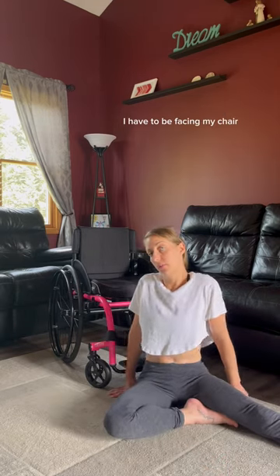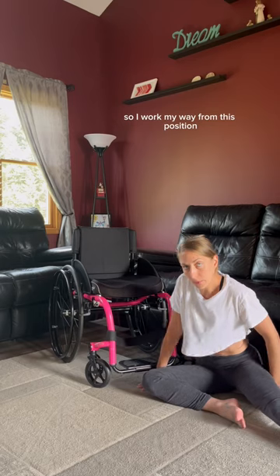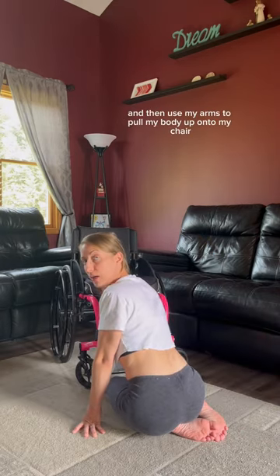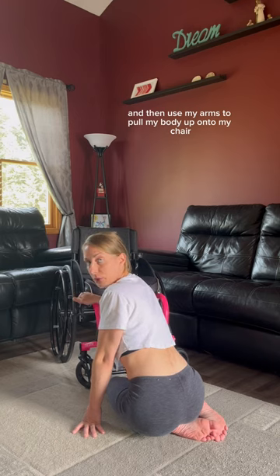To get back up, I have to be facing my chair, so I work my way. From this position, I will go up onto my knees and then use my arms to pull my body up onto my chair.